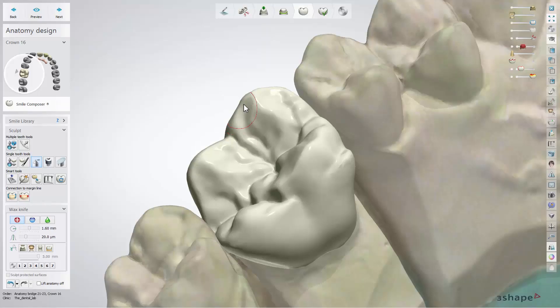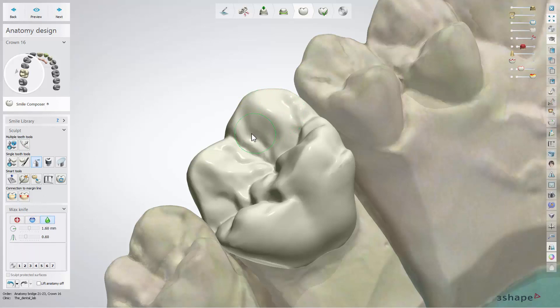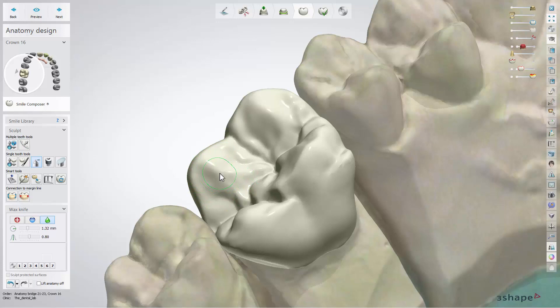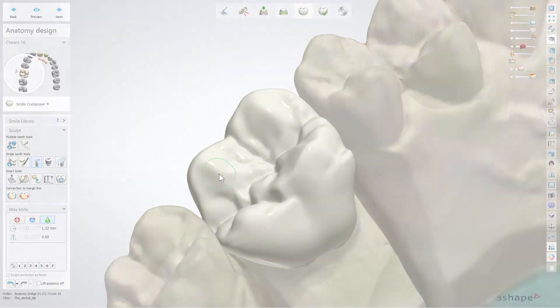Use the Wax Knife tool to add and remove material to and from the design and to smooth its surface. Choose one of the three options and click on the design to apply the operation. Select the radius and level of influence of the wax knife by using the two slide bars. Alternatively, use Shift plus the mouse wheel to change the radius and Control plus the mouse wheel to change the level.